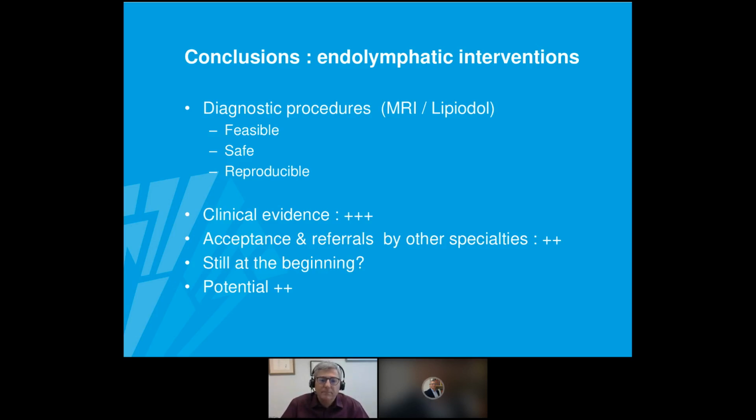Do you place a sheath after puncture of the chyle? For which indication? For thoracic indications or for abdominal indications? It is not well specified.